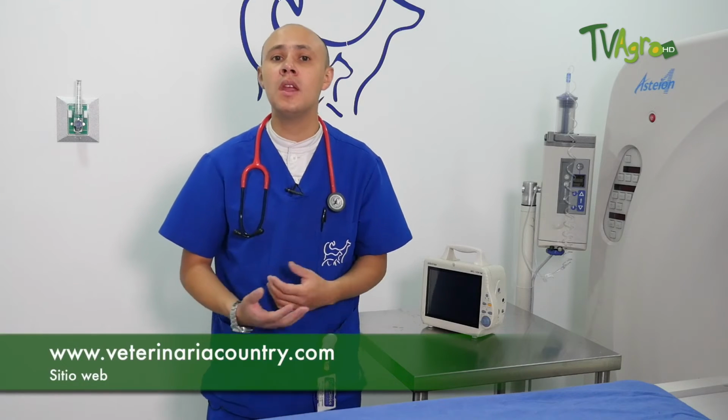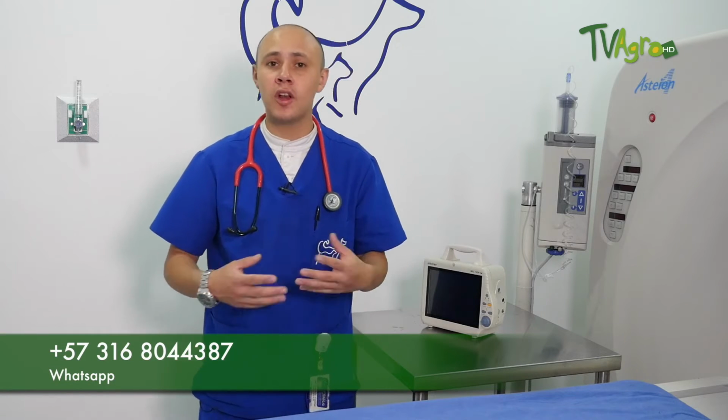There are patients in whom I do not recommend generating this procedure, mainly patients who are lung unstable. We have had cases in which patients come with a very severe pneumothorax, so they become complicated at the time of anesthesia. We have not had any failure in such procedures, and patients have left. But fortunately, we have a trained medical team that can solve the problem at the same time. You, as veterinary doctors, if you are going to submit a study of these, we try to send a patient as stable as possible, to make this procedure as successful as possible.